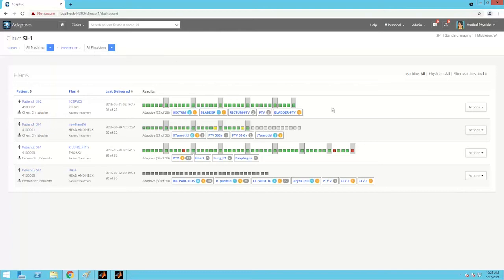So then let's go and look into an adaptive module case. The most interesting one we have here is one that shows failures from the in vivo module in fractions 9 and 36, as well as an average failure for the end of treatment. So since we've already gone in and looked at some in vivo analysis results, I'll just click into the PTV, and that will take us into the adaptive module results based on the cone beam CT.